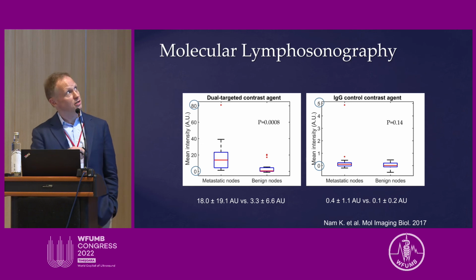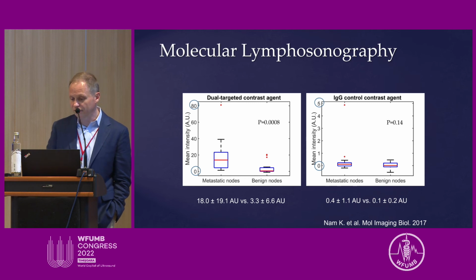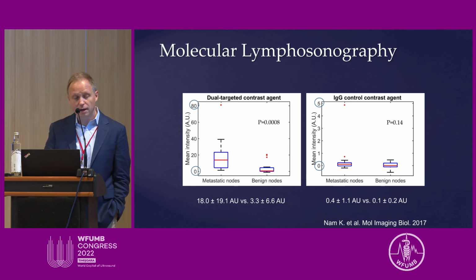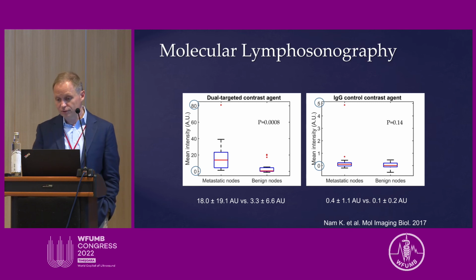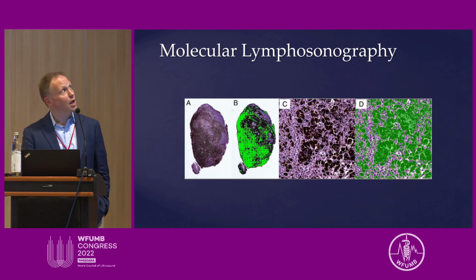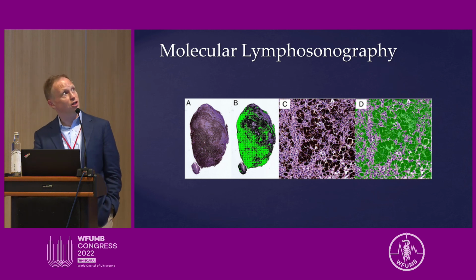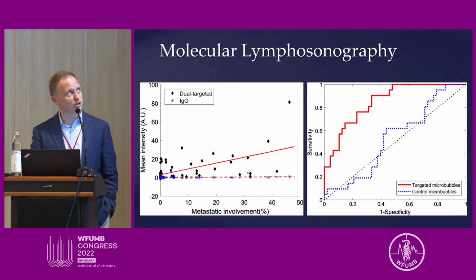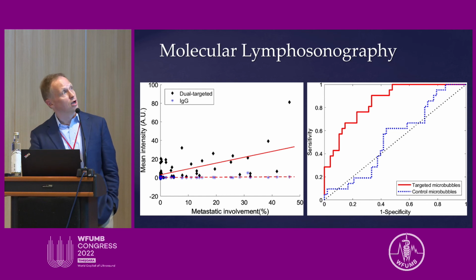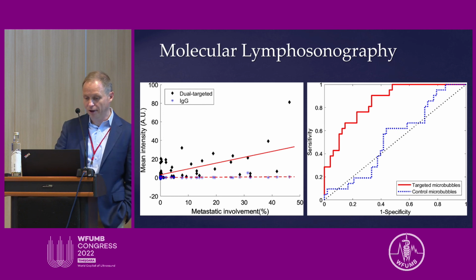It was a very statistically significant difference, so I think this technique, when we have clinically available molecular ultrasound, will be very, very helpful because it will combine our ability in finding lymph nodes with ultrasound and also characterizing them as well. Our results were also confirmed with histology and immunohistochemistry, where the amount of retention of the microbubbles in the lymph node really nicely correlated with the degree of expression of the targeted proteins in the tissue.